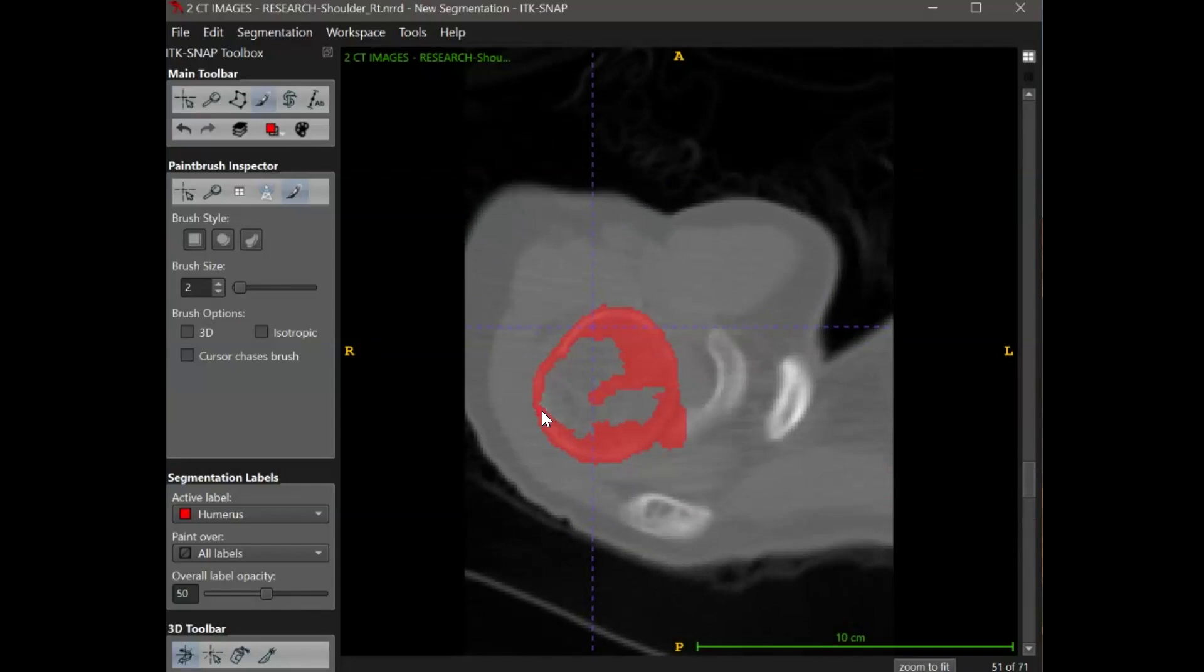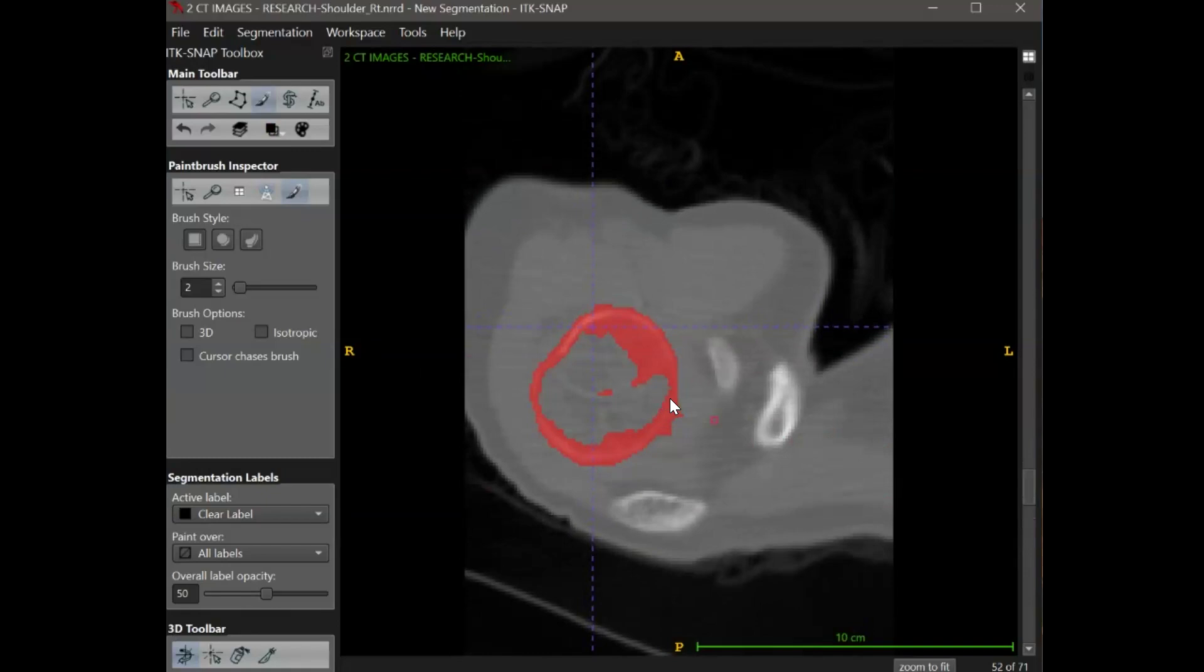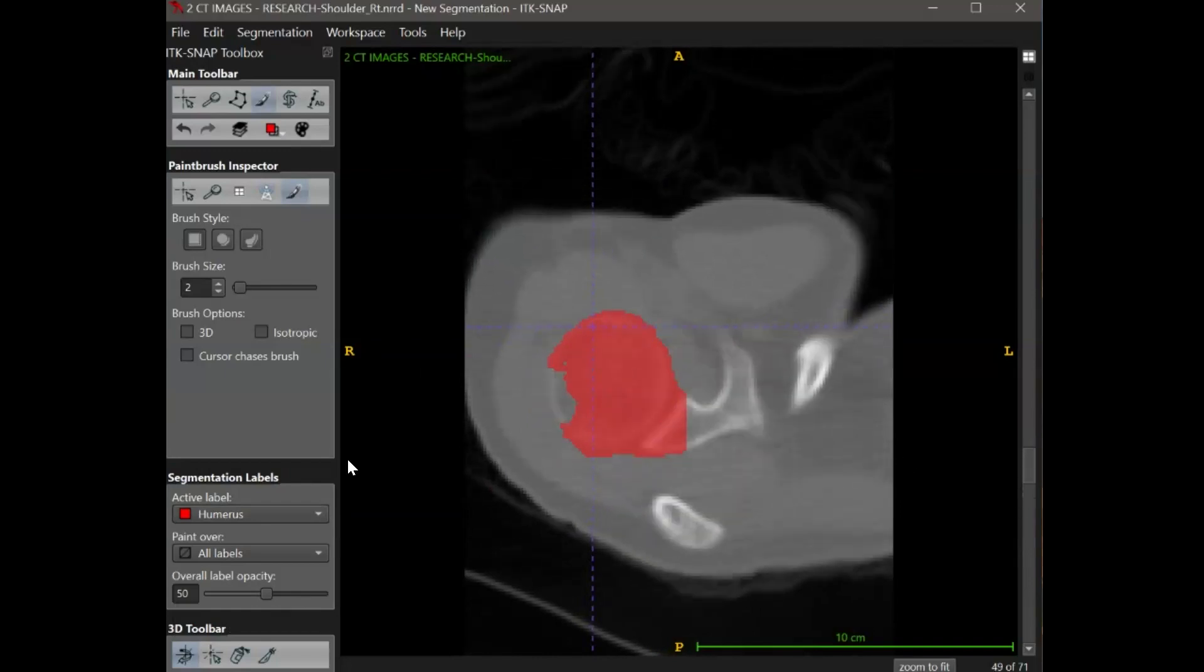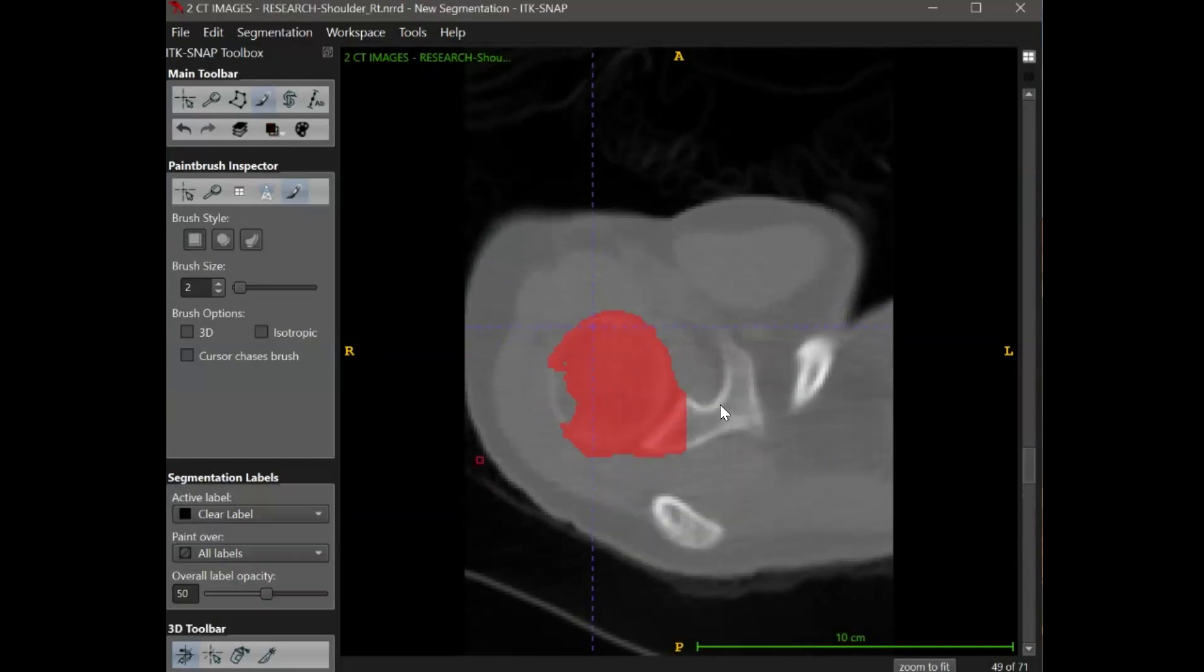In my example, part of the segmentation started to bleed into the scapula. For this case, I would want to go back and remove that part from the segmentation. The options are to rewind in the active contour or to edit the segmentation manually. You can edit the segmentation created by the snake tool with the manual segmentation tools that we covered in the beginning of this video, like the paintbrush or the polygon tool.